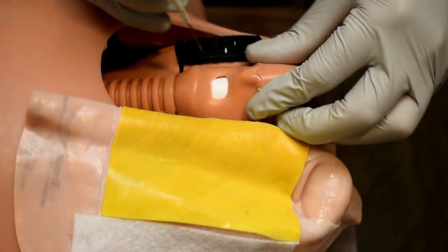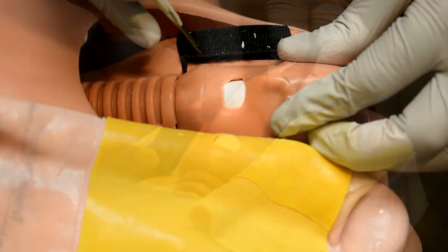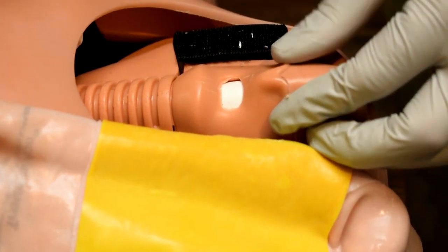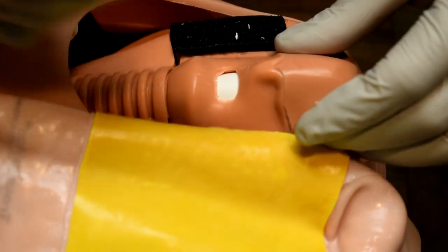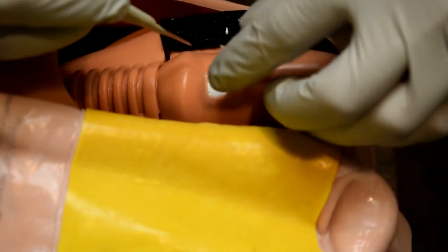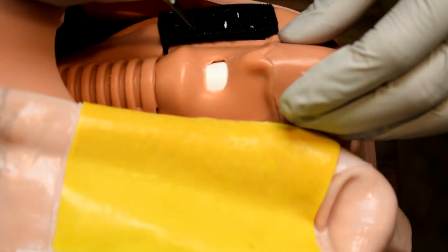Then you're going to turn your knife and you're going to cut horizontally into the cricothyroid membrane. And this is almost a controlled stabbing technique. You need to puncture the membrane, and then you're going to cut across horizontally. You will know that you are in because you will see air release, and you'll hear air release, and because it is bloody, you'll usually see air pass by some blood that comes up. So that's a quick internal demonstration of large sequential cuts, feeling back and forth. I would not recommend sticking your finger in with the knife at the same time in the hole. That is dangerous to you as the surgeon. Once you feel that you're all the way down, you turn the knife and you're going to cut horizontally.